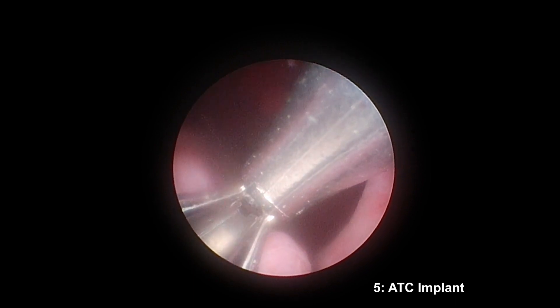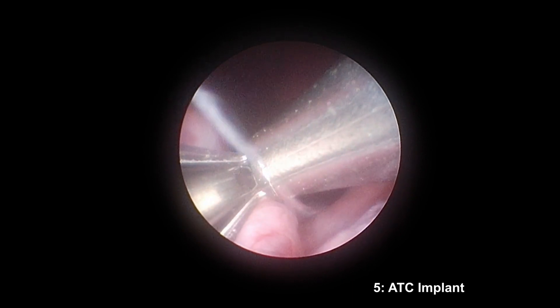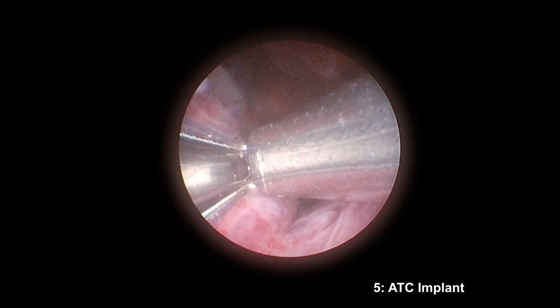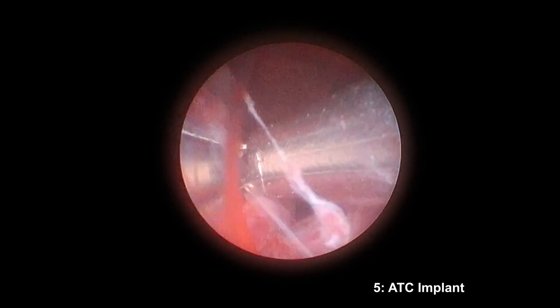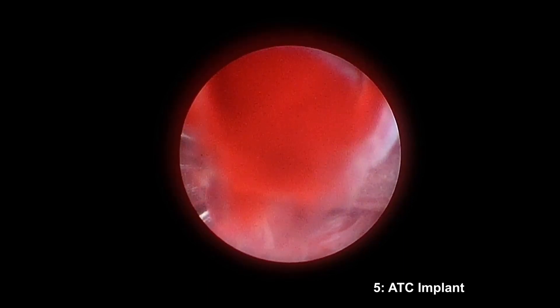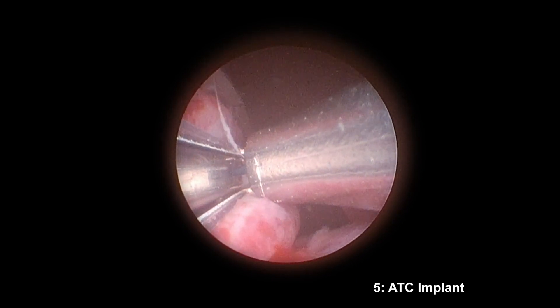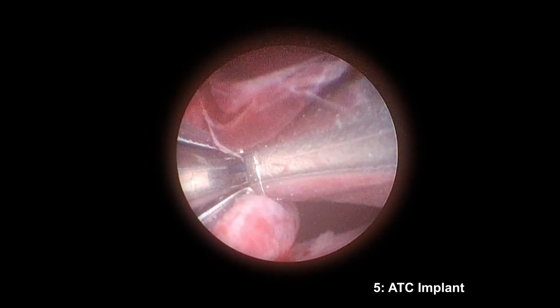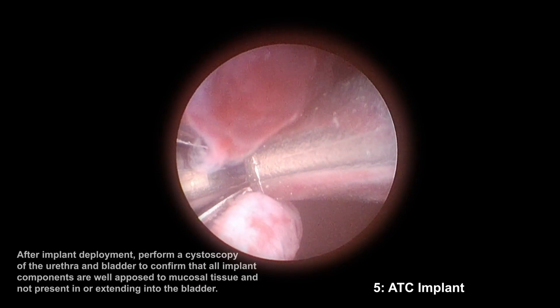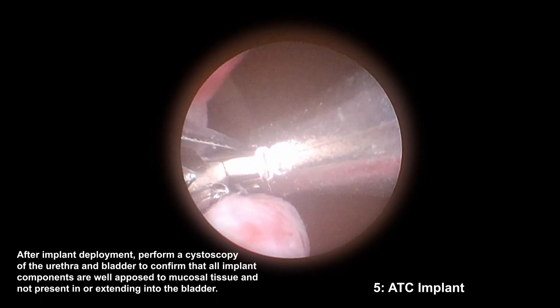I start with the keyhole at the bladder neck, then drop the ATC wings over the OML and slowly rotate the device clockwise while gently retracting the OML distally into the prostatic urethra and laterally toward the patient's right side. This is a slow, deliberate process. I pay close attention to the ATC's wings and do not retract against resistance. I then ensure I have an appropriate angle of compression, generally greater than with lateral lobes. I deploy and retract the needle. Then I perform the white line maneuver by slowly advancing proximal while looking for the white line to appear on the suture. I take care to not advance too close to the bladder before placing the urethral end piece and completing the implant.